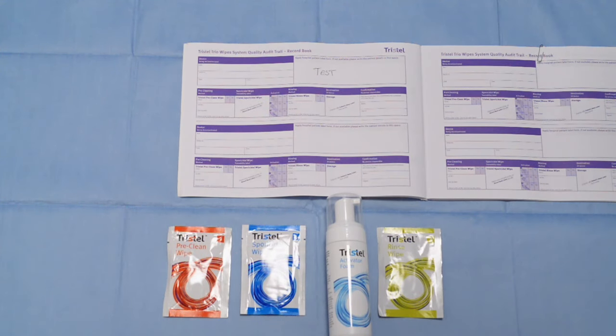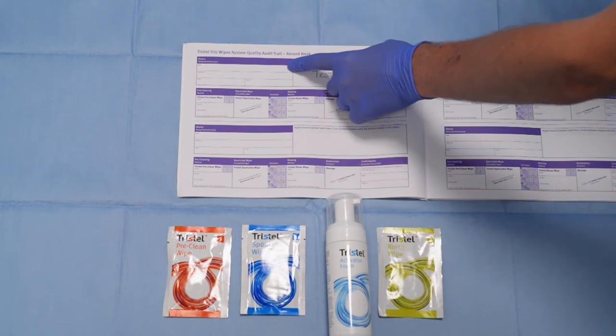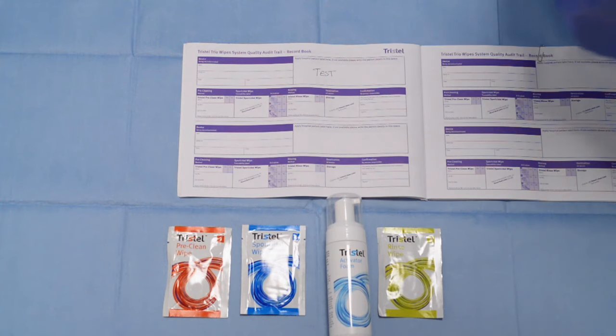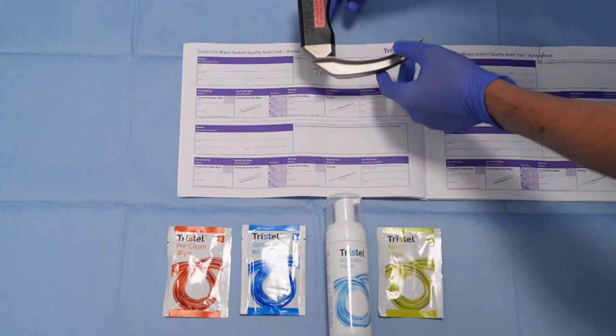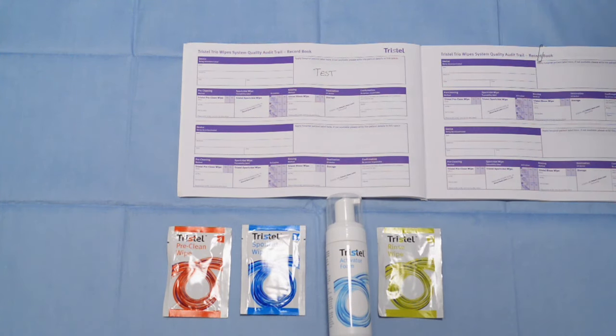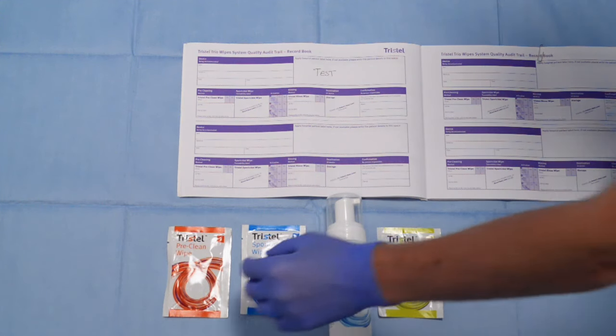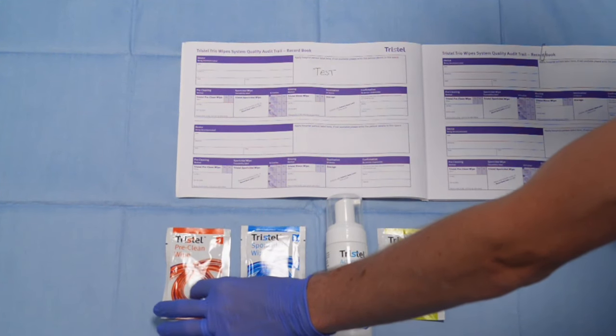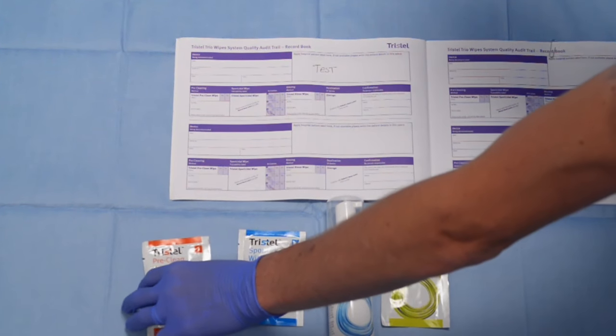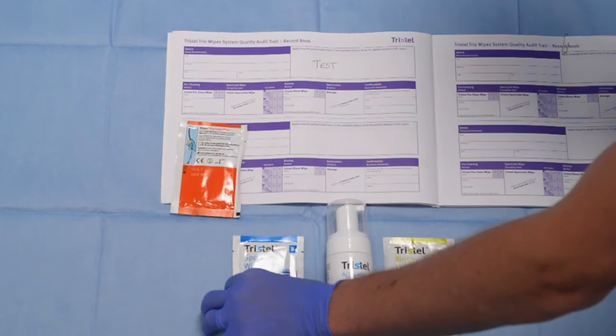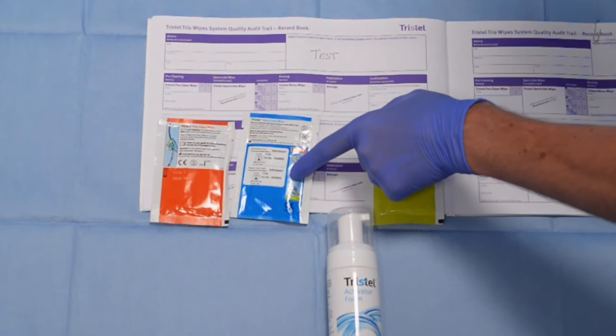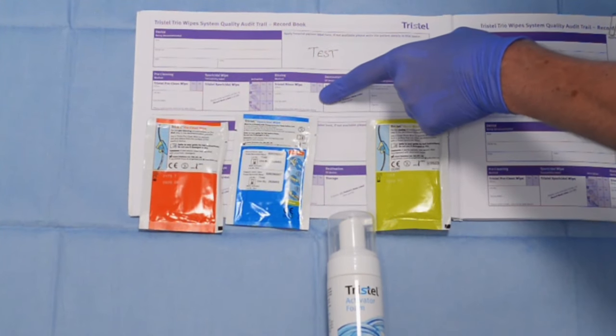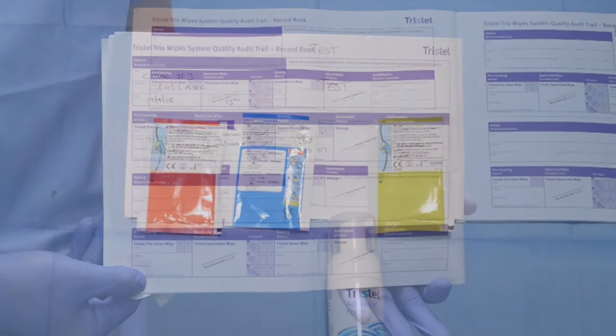Today we've written a test label, but normally a patient label would go here. The item is the CMAC video laryngoscope blade. The serial number is a unique number for each blade, 843 AXE in this case, which goes in here. Include the date and time. Each wipe is numbered 1, 2A, and 3. They all have a lot number and expiry date, which is all documented. 2A comes with a sticker which goes in. Then you're ready to do the process.